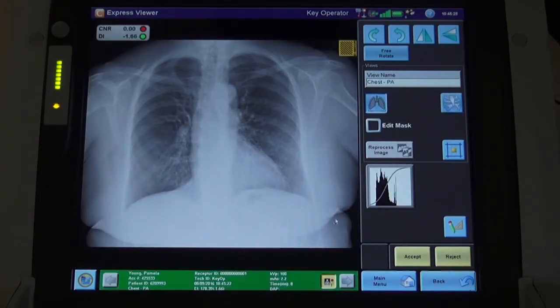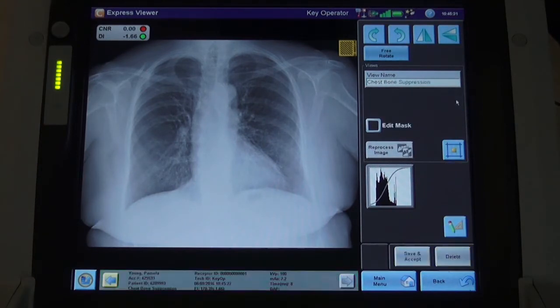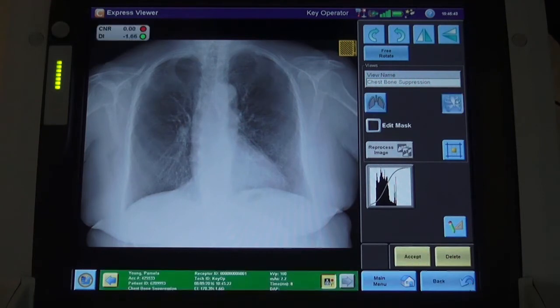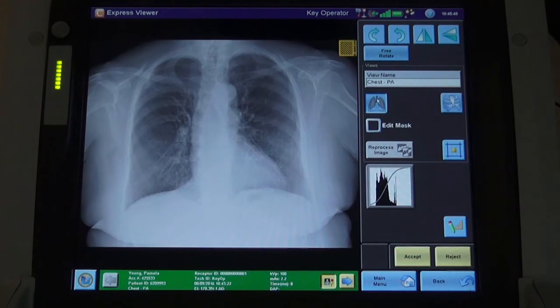The original image is reprocessed to produce an image in which the posterior ribs are digitally removed to better visualize the lung fields. The radiographer has the ability to toggle between the two images by selecting the proper icons.